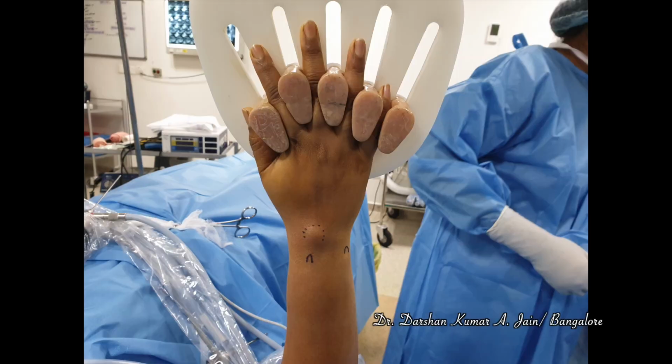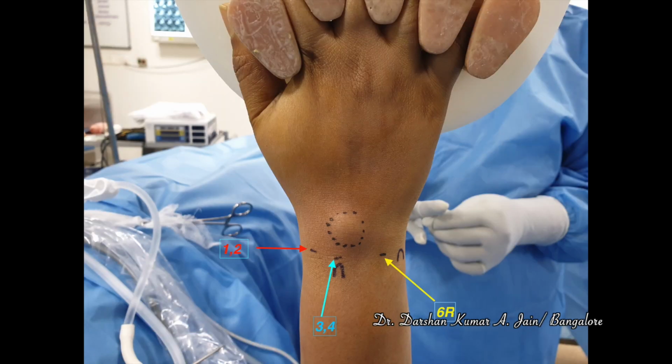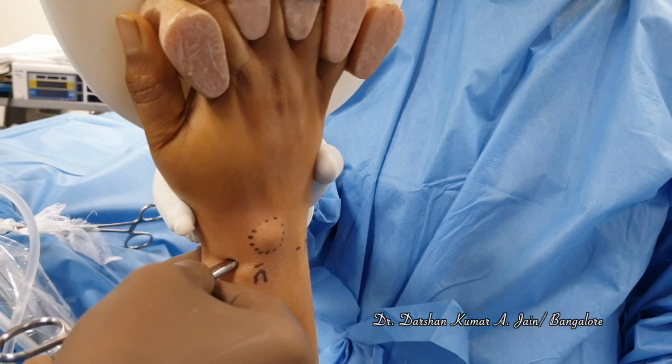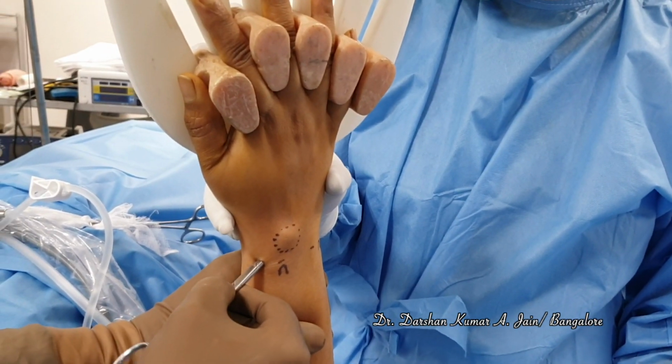Typically dry arthroscopy is done, and this is the setup. The 1-2 portal and the 6R portal are the most commonly used portals. They can be used interchangeably as a working portal and the visualization portal. This is the 1-2 portal, which I'm going to use for the visualization.